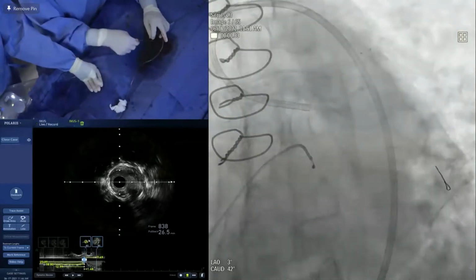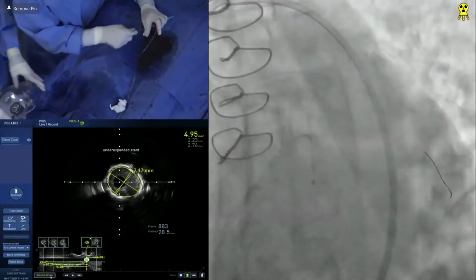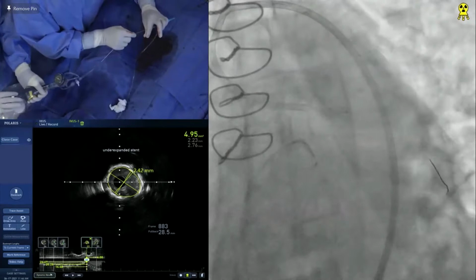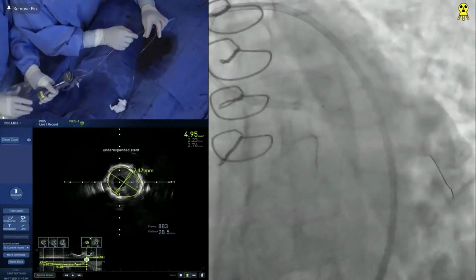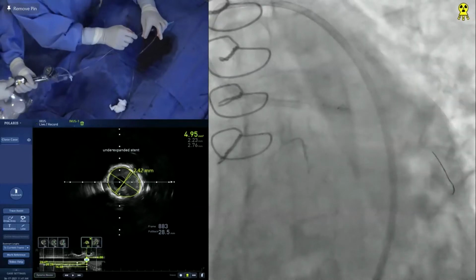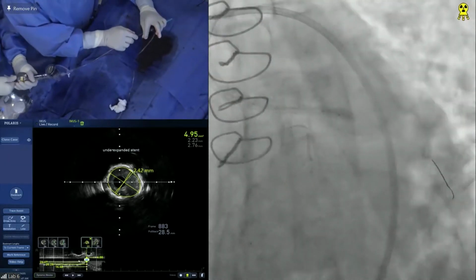So you see the expansion. We know exactly what it is beforehand and now. Now question is to Colombo. I know he was very big on this using a cutting balloon. But question is, how will the cutting balloon work now when there is already a stent? We have used this cutting balloon with a stent a lot.